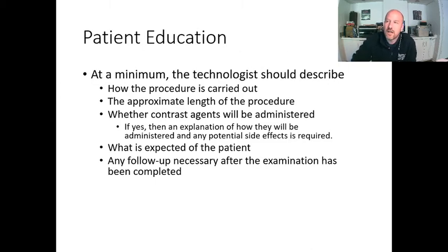So finally, we are working, as I've mentioned previously in this lecture, as educators. We're going to be educating our patient about how the procedure works, how long it's going to take, whether or not we're going to be using IV contrast, and a little bit about what IV contrast is, and what's expected of the patient.